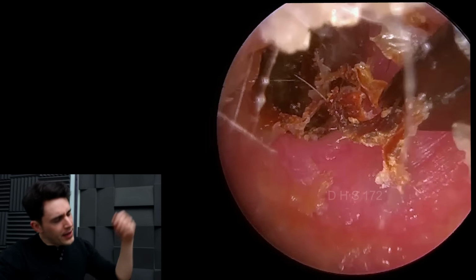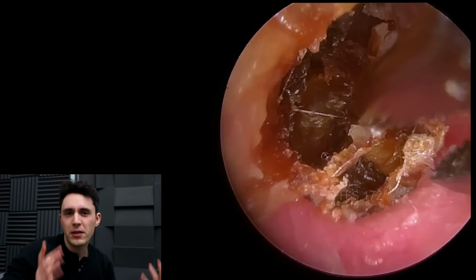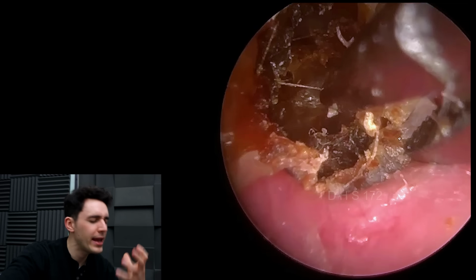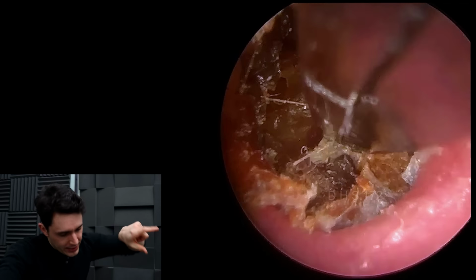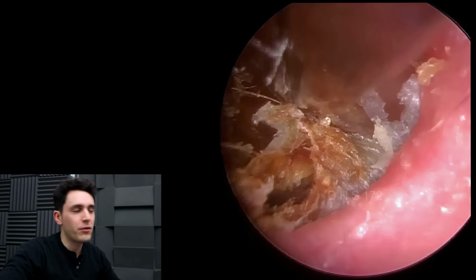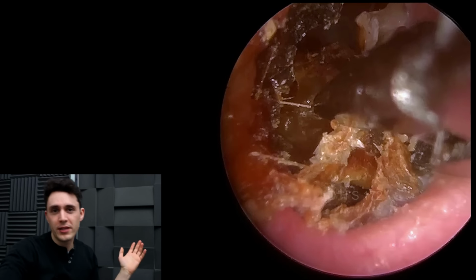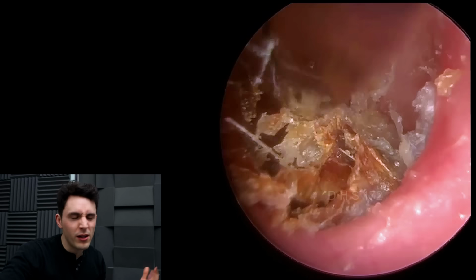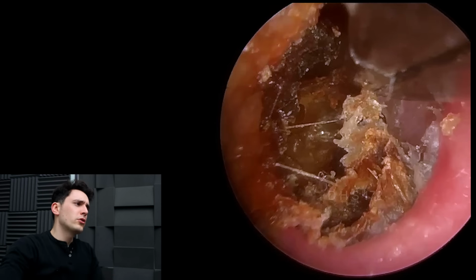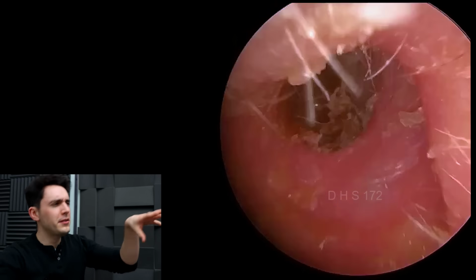So anyway, at the end of the last video, I thought, great, this guy is near enough sorted. It took ages to clean out the ear and get all the mess out of the cavity, but I was pleased and I thought we'll send this guy off to ENT and he'll wait a while, but it doesn't really matter too much. Just keep the ear dry, it'll be fine. So this is what we have now.